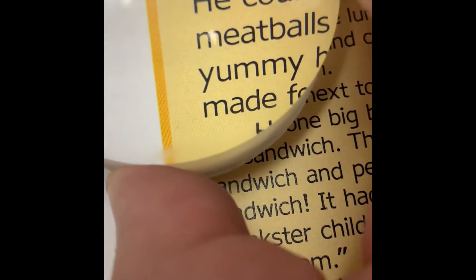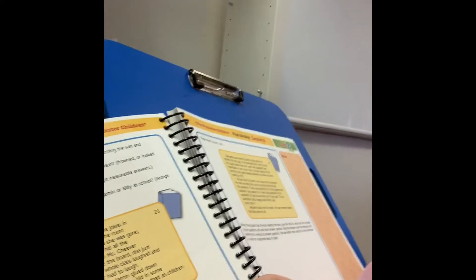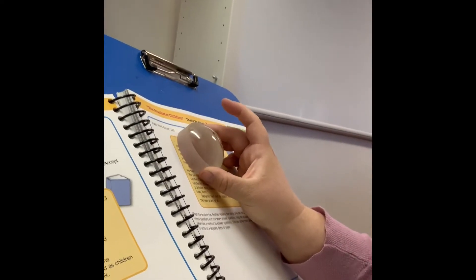Go back to the beginning, but focus one line down. Don't hover over the top of it — that's going to hurt your neck and your back. Make sure your book is working for you. Put it up with a slant board, and then you can use your dome with the slant board to keep a nice upright posture.